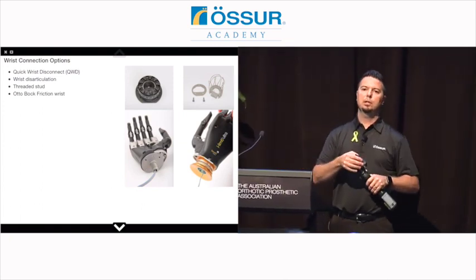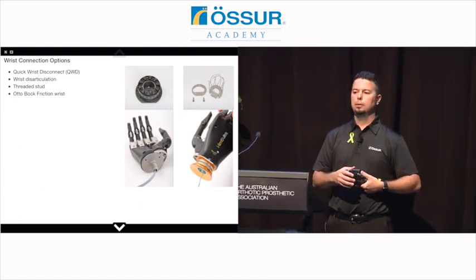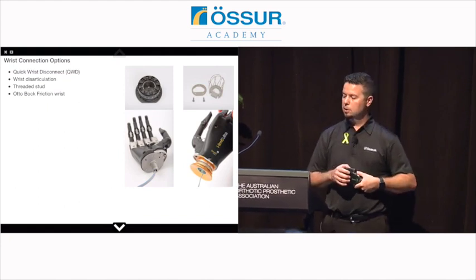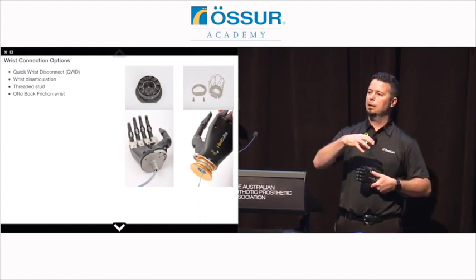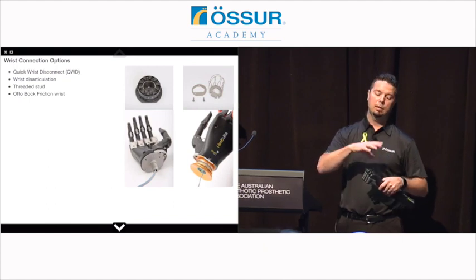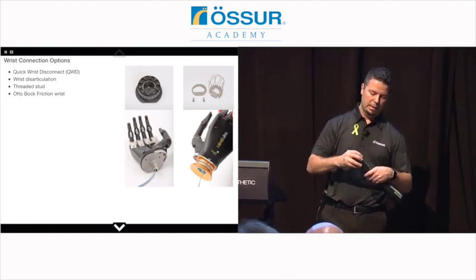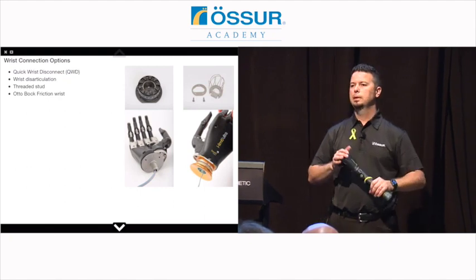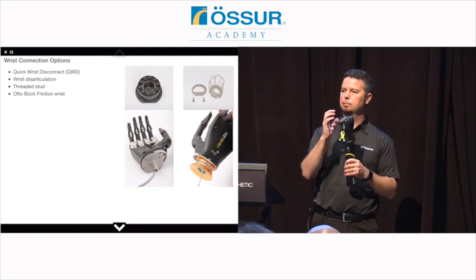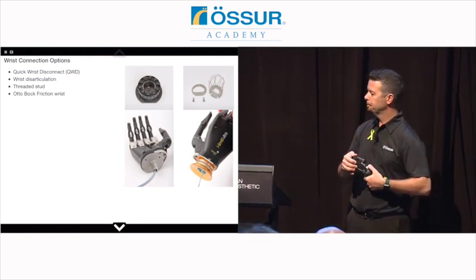You have a wrist disarticulation level, or maybe there's weight restrictions, whatever it might be. There is a wrist disarticulation version. That's the one in the upper right. That has that little basket that gets laminated into the prosthetic frame. What you give up with that version is pronation and supination. So with that wrist disarticulation version, you get a shorter build height, but you lose pronation supination.